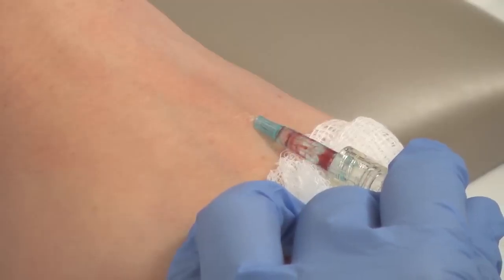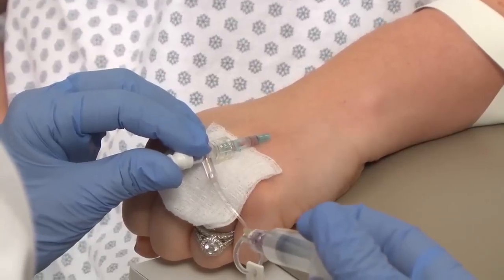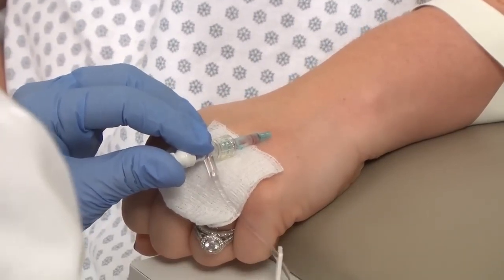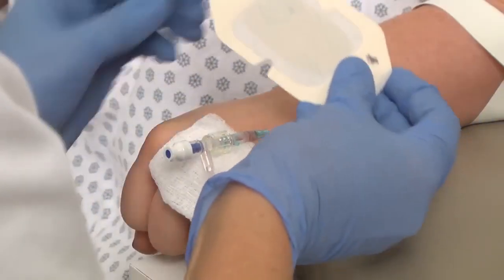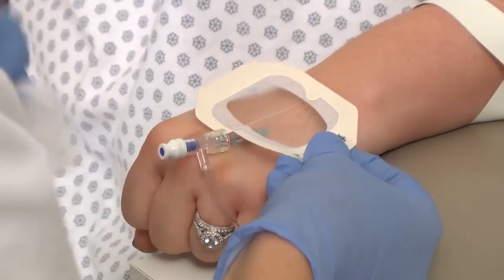Watch the patient for any signs of pain and ask them if it feels okay. Remind them that it may feel cold but should not hurt. If there is no swelling or pain, secure the angiocath with a transparent dressing.